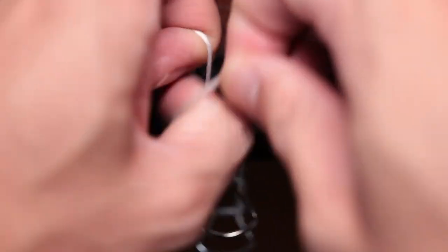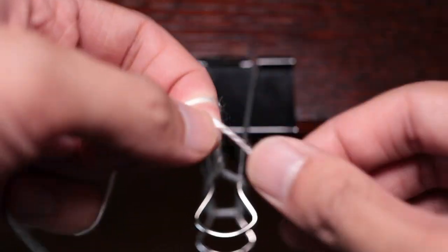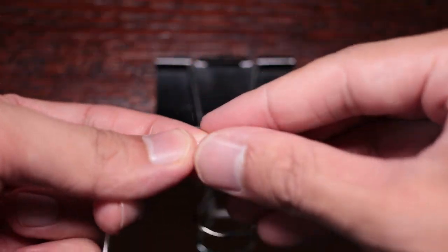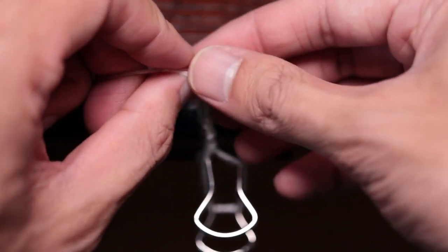It's definitely slower than the one-handed knot and not the preferred knot by most surgeons and students, but it's one you have to know in case you get pimped on it in the operating room. By learning it this way, it becomes almost a one-handed knot because the left hand does most of the action and the right hand only assists, making it less confusing.